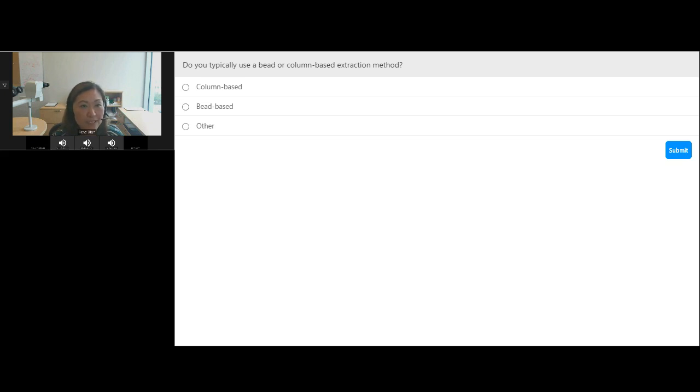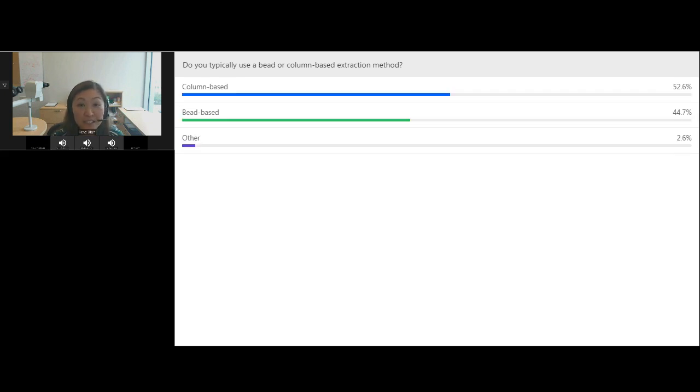Okay, so let's take a look. Wow, so this is very interesting. So about half and half. And then there is a small minority that use another method. So it's very interesting, and this is something you might think about as you start to discover this IG sequencing assay, is that if framework 1 amplicons are important, you may want to optimize that initial DNA extraction process.